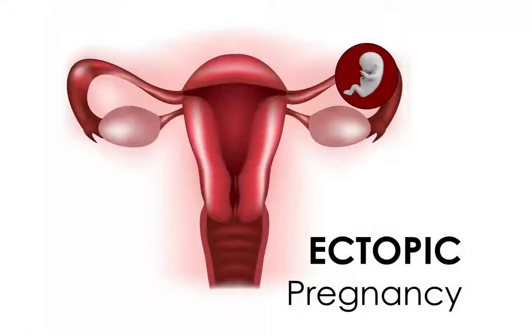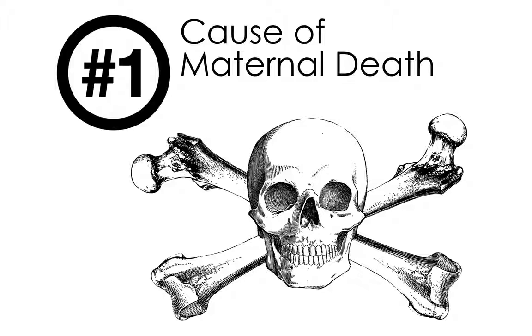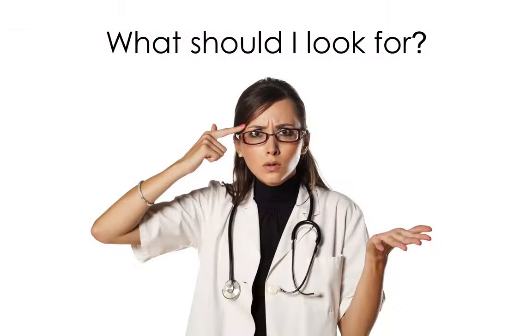In this section, we will discuss the diagnosis and management of ectopic pregnancy. Ectopic pregnancy remains the number one cause of maternal death from pregnancy. However, with ultrasound, the morbidity and mortality of this disease has plummeted over the past 4 decades. So what will you see on ultrasound with ectopic pregnancy?